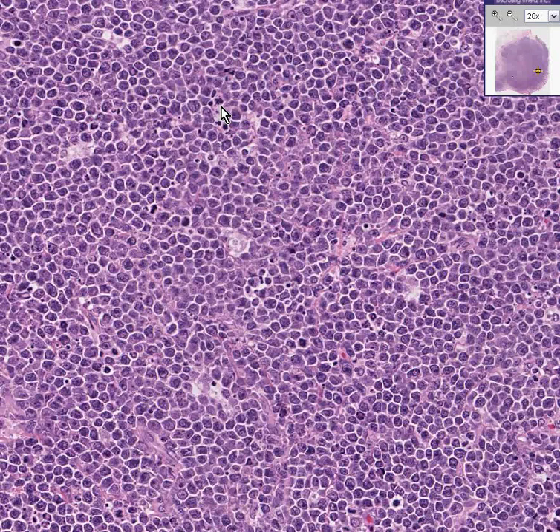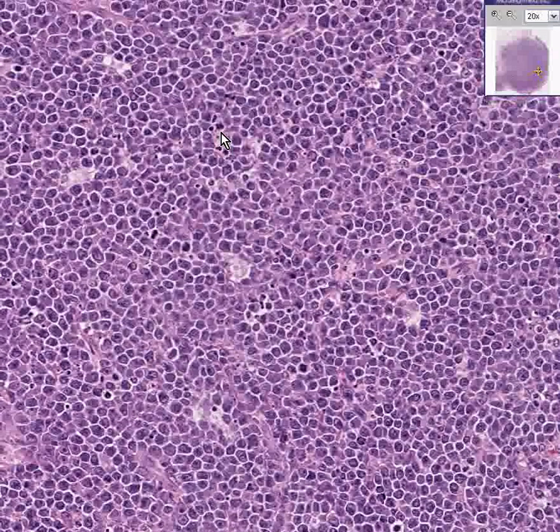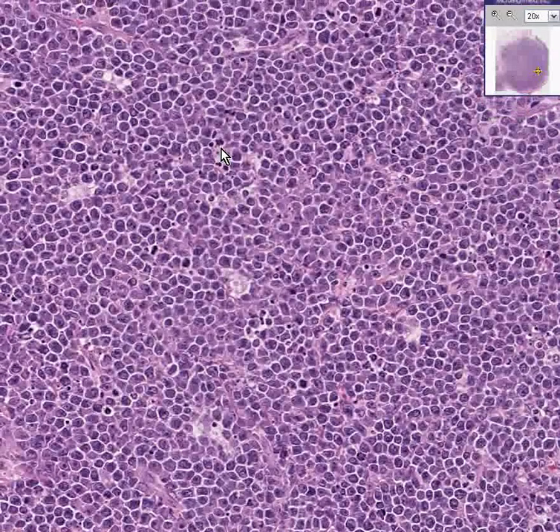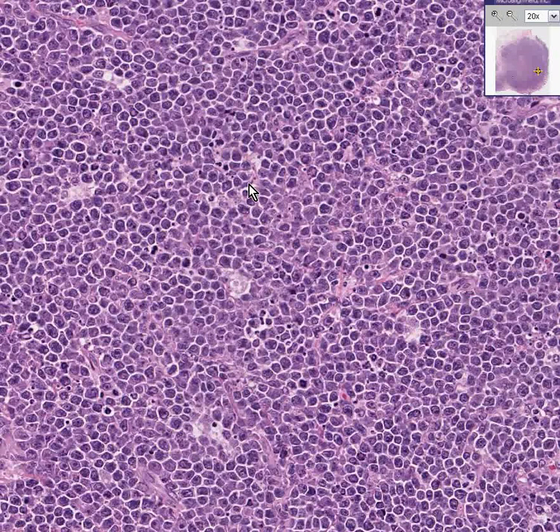In addition, this one looks like an abnormal mitosis — it doesn't look like your normal bipolar mitosis. This is Burkitt's lymphoma of the colon, and thank you very much.